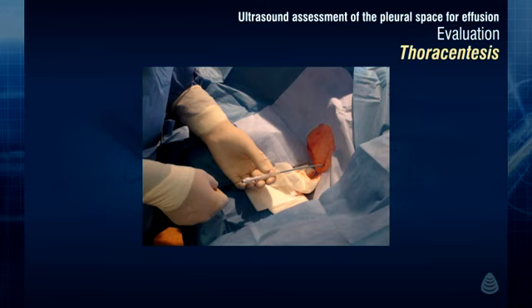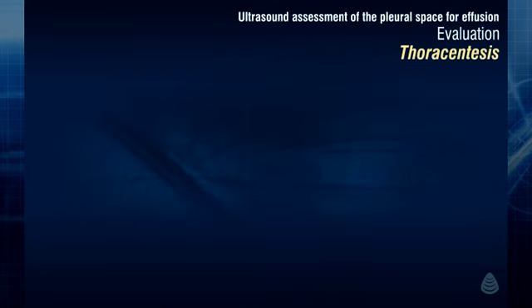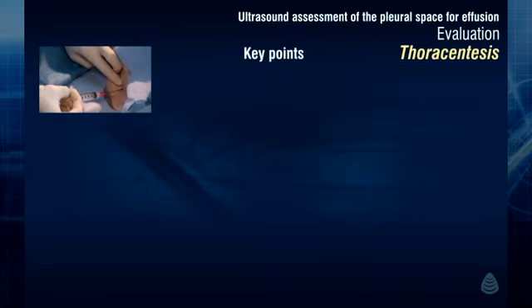It is important to note that although we use the term ultrasound-guided thoracentesis, in the vast majority of cases, real-time ultrasound guidance for needle insertion is not used, so the needle insertion is not directly visualized by sonography. Let's review step by step how ultrasound should be used to assist in performing a safe and efficient thoracentesis.